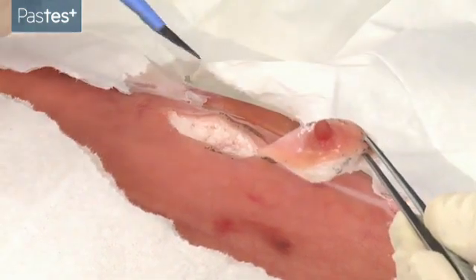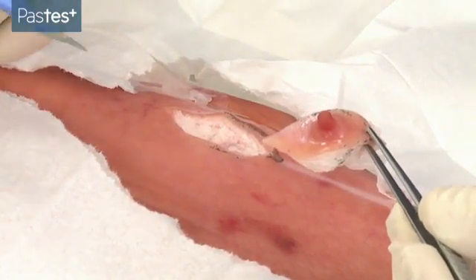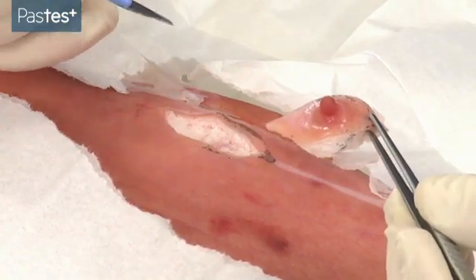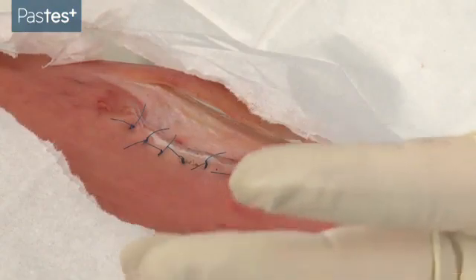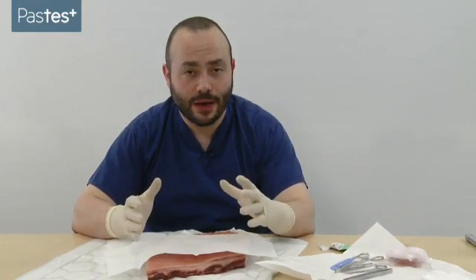You should then, if you have the time, close the wound in an appropriate fashion. Here I'm going to use vertical mattress sutures with a monofilament non-absorbable stitch. Having closed your wound and sent your lesion for histology, dispose of your sharps in a safe way.